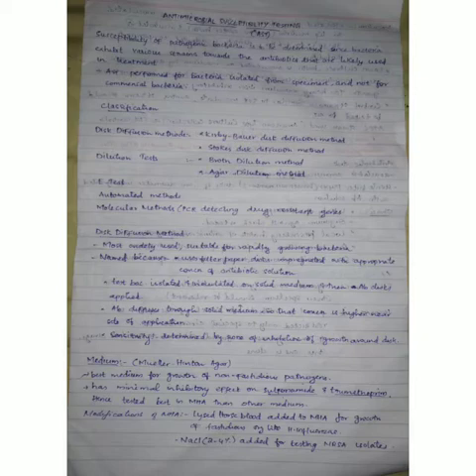So there will be a zone where growth is inhibited, and according to this we will determine the sensitivity. Next we go on to the medium, and the medium used here is called Mueller-Hinton agar. This is the best medium for growth of non-fastidious pathogens, since it has a minimal inhibitory effect on sulfonamide and trimethoprim, and it will also support satisfactory growth of most of the non-fastidious pathogens. So we use this medium rather than any other.